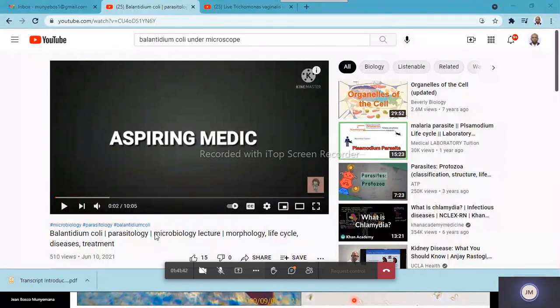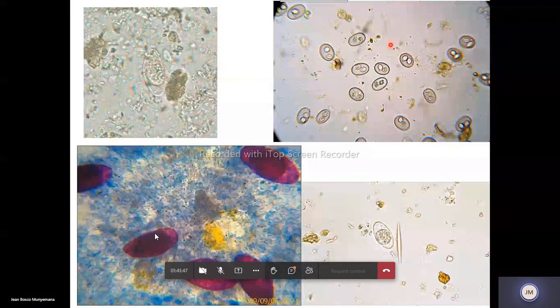So this is Isospora belli on wet mount. It's like this. It has an egg shape like a chicken egg, or a cyst of Giardia, but inside you can see two nuclei, and very, very big nuclei that are easily seen. Or you can even not see this one, but you see very big central nuclei that can easily be seen.